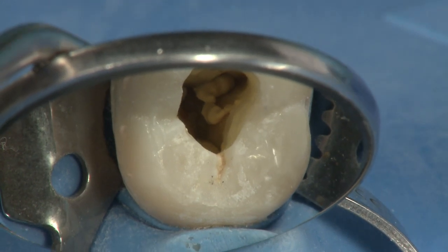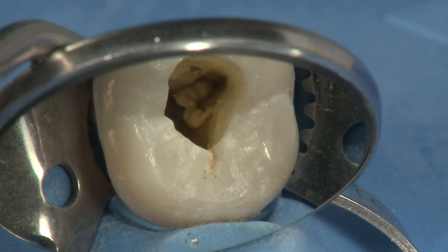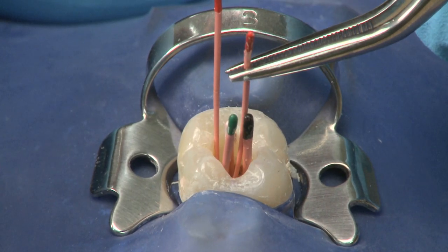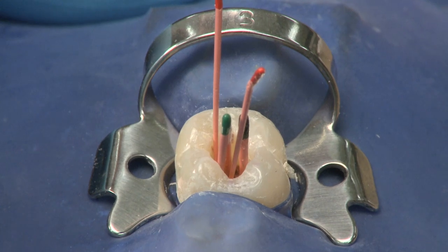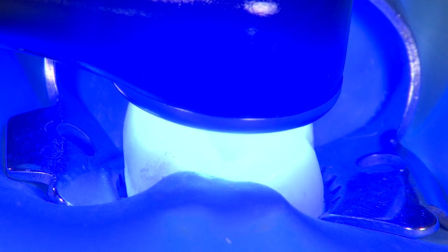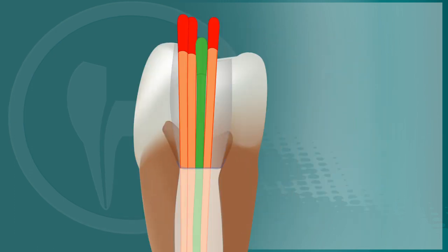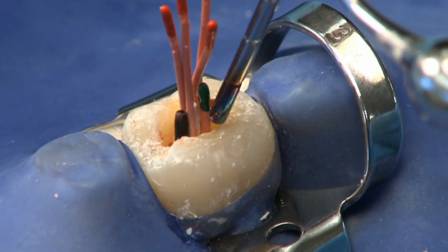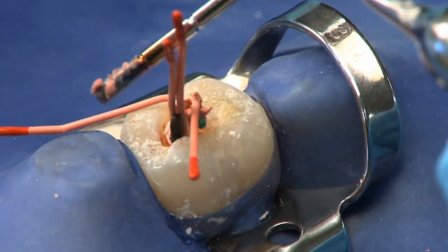At this point you have up to 15 minutes of working time before EndoRes begins to polymerize. Place your pre-fitted EndoRes master cone back into the canal and set it to working length. If necessary, use an x-ray to confirm the EndoRes point has been fully seated at the apex. Add additional number 25 accessory points to fill the open space. Once gutta percha is properly placed, light cure the surface of EndoRes for 40 seconds — this creates a thin crust of set material preventing an oxygen-inhibited layer on the surface of the sealer. EndoRes should be completely polymerized in 30 minutes. Using a heated instrument or searing device, trim the excess gutta percha from the pulp chamber.